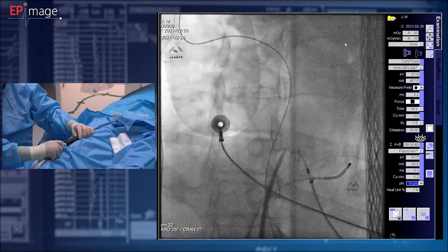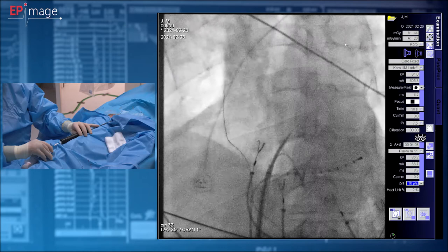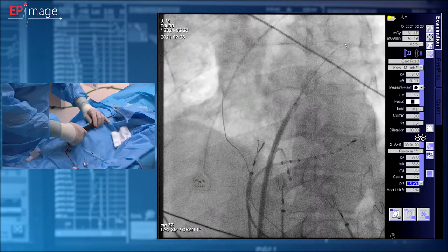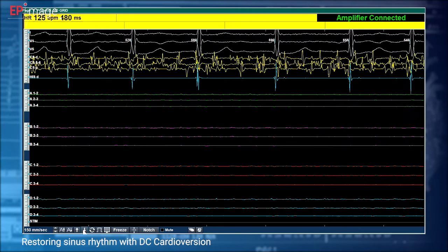Now we'll check the position of our catheter in RAO. Then that's what I'm doing here. You've seen already that the needle is inside the left atrium and the bit of dye contrast is in the left atrium. I'm not pushing the whole set before changing the needle for the introducer wire. I want to be sure that it will be safe to cannulate the left atrium with the whole stiff system.